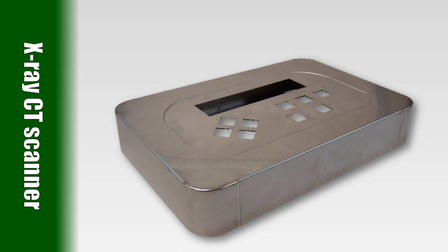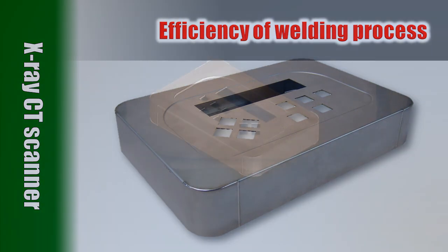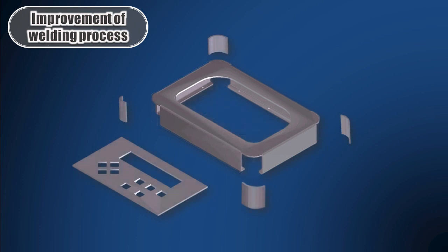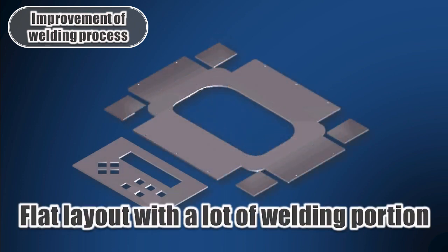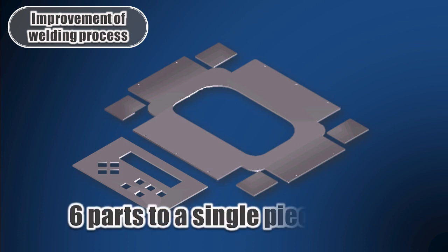Next, we would like to take the CT operating panel as an example to show how we can improve the efficiency of the welding process by integrating parts. This product, with such shape, consists of 6 parts, and since they are mostly welded together, it takes time to assemble. Here, we will integrate those 6 parts into one single body piece to reduce the welding process.